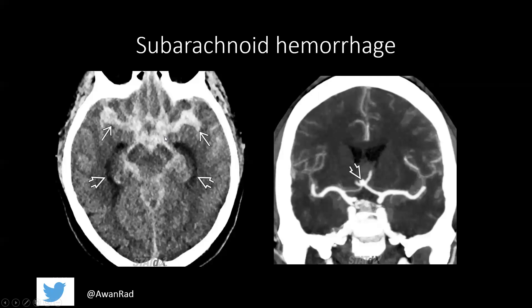Subarachnoid hemorrhage should be thought of as blood within the sulci or the cisterns. This star-shaped cistern is known as the suprasellar cistern — it should normally be dark like CSF, but here it's bright because it's totally filled with blood. This smiley-face cistern is known as the quadrigeminal plate cistern and also contains subarachnoid hemorrhage. Linear areas of bright density within sulci also represent subarachnoid hemorrhage. Any hemorrhage within sulci or cisterns is subarachnoid hemorrhage.